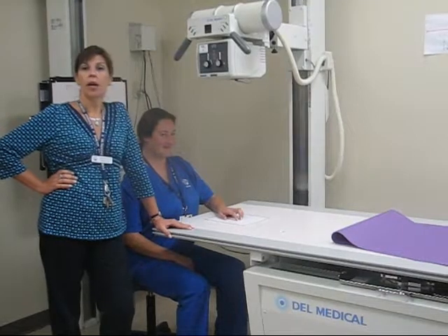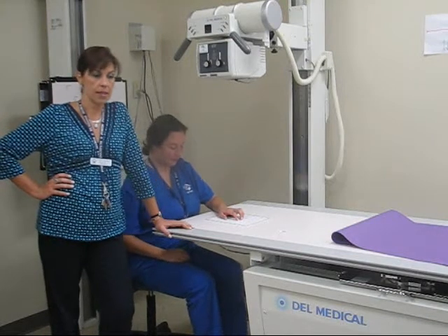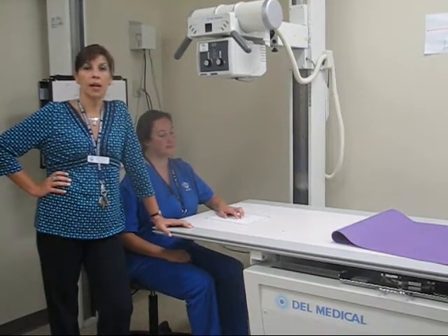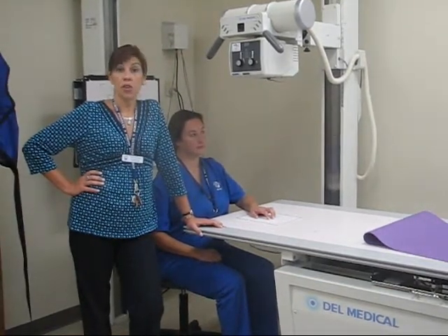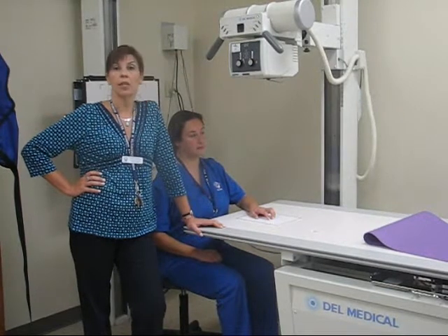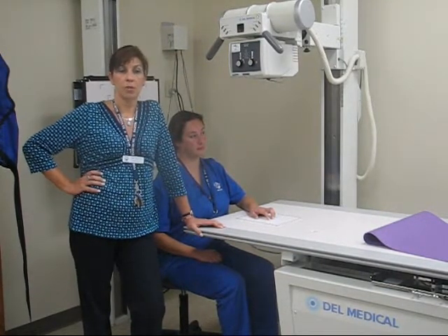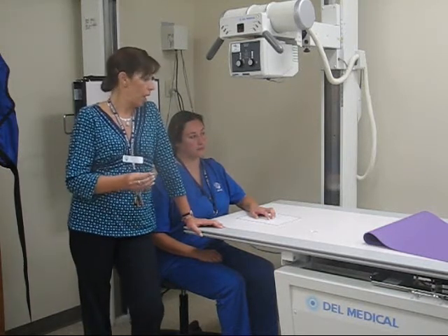Today we're going to review projections of the hand, the fingers, and the wrist. Projections of the fingers are usually done together with the hand. However, under certain circumstances, the doctor may want just a projection of the finger or fingers in question.